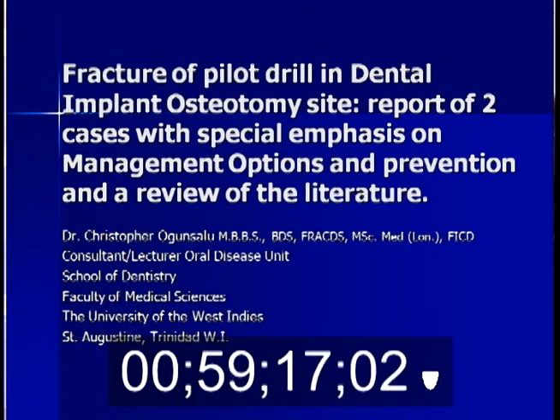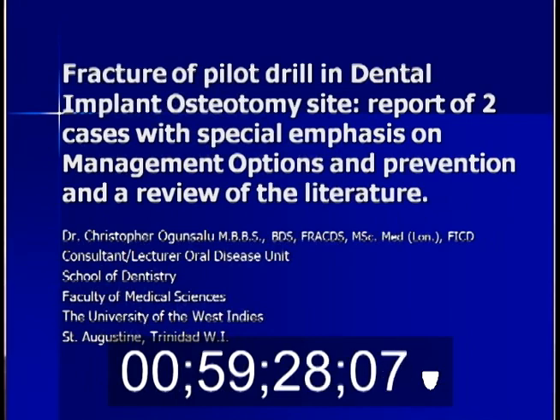So causes of fracture of pilot drill. Another lesson to learn. Lack of lock or engagement into the handpiece. Lack of lock or engagement into the extension drill. Excessive pressure in D1, D2 bone. Next. And that's it.